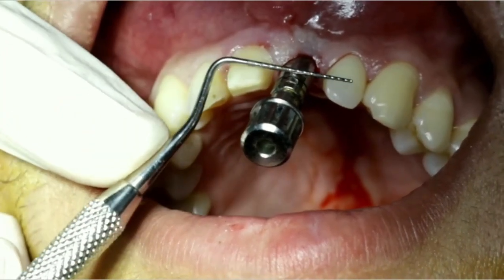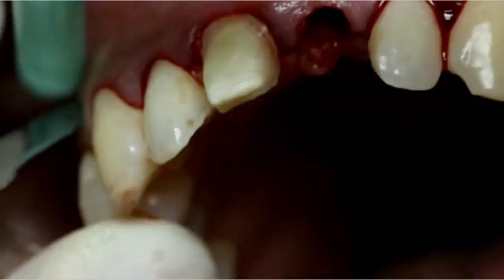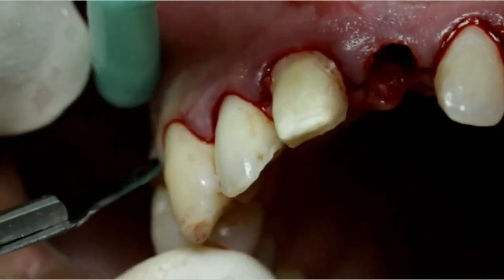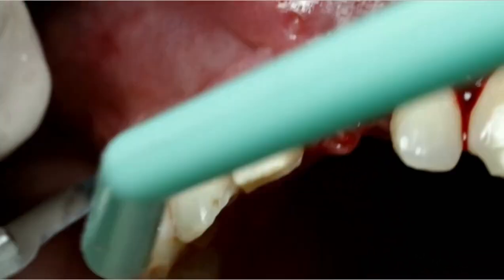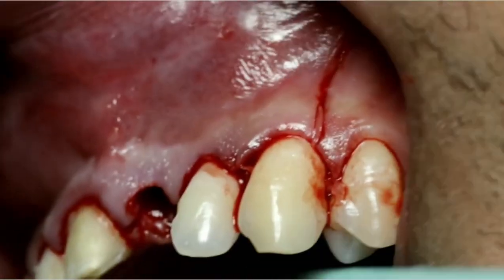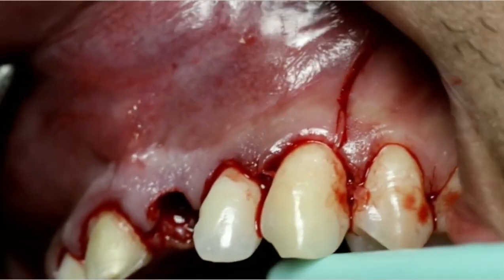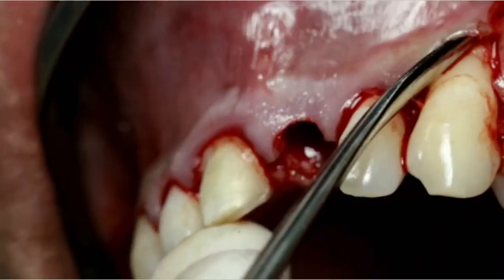But this case needs ridge augmentation, so we start our ridge augmentation procedure and make our remote flap design with two vertical releasing incisions, reflection of the labial flap, and exposing of the bone deficiency area.